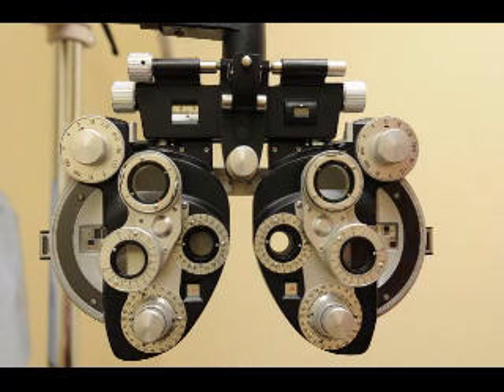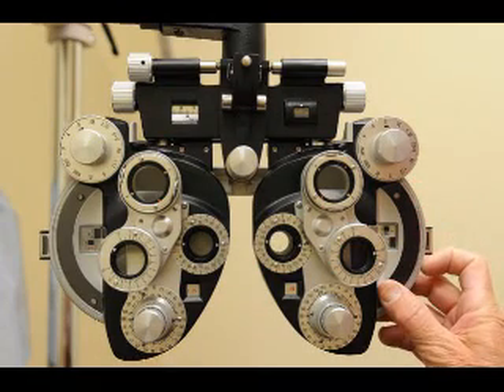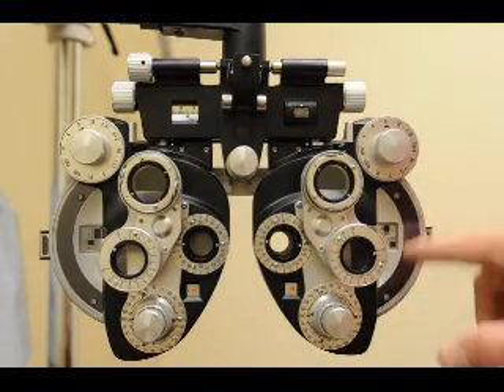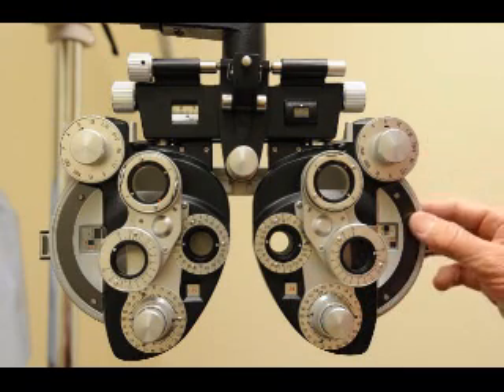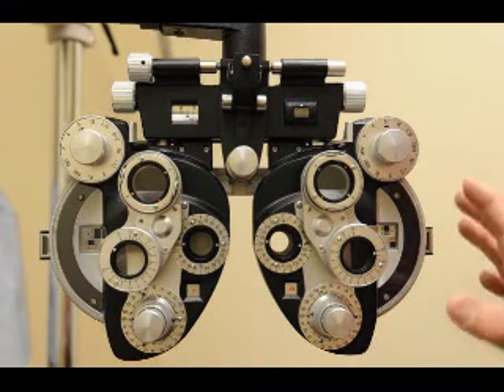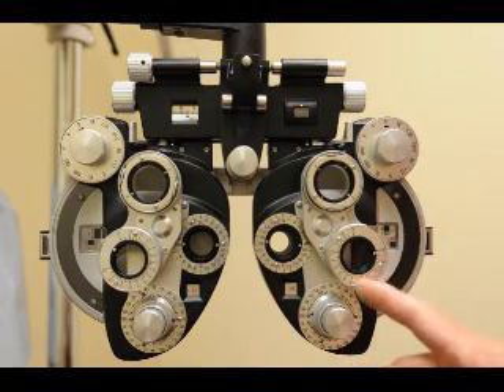Take the Jackson cross cylinder out — plano. 'Read those letters as best you can.' They read it. Put up 20-25, they read it; put up 20-20, they read it. 'Does that blur it just a little bit?' Add a half plus — they say yes, it blurs. Take it out. That is the prescription — finished. You cannot assume that because they see 20-20 with the autorefraction and it's plano, that is their prescription. You still have to check sphere and cylinder.